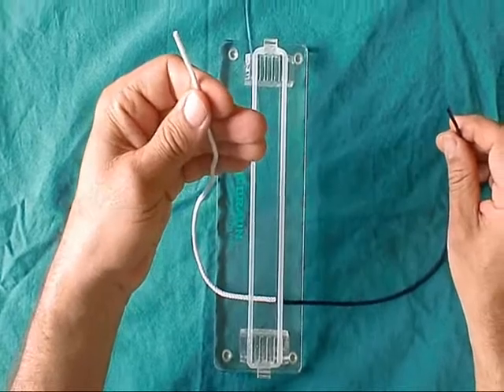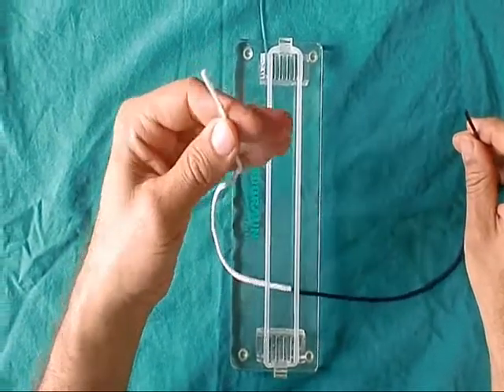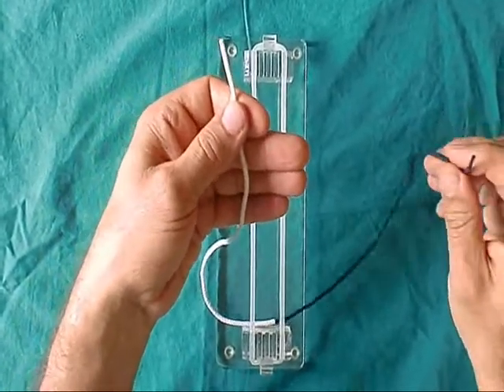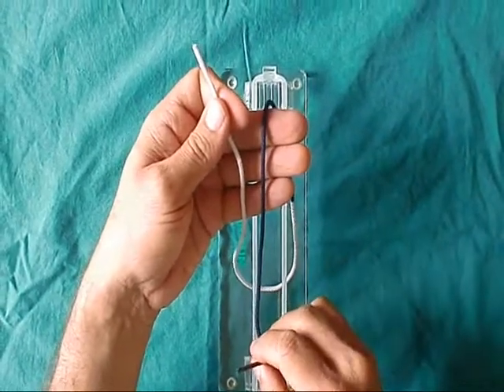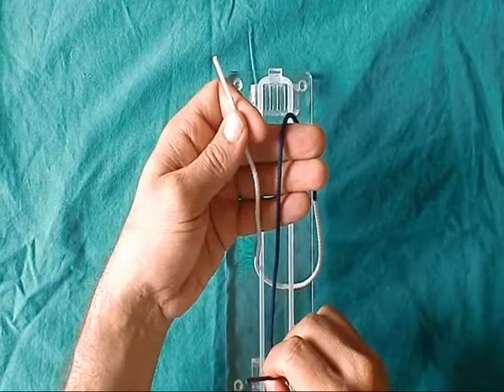Hold the thread in your left hand in this fashion. Make a loop with your right hand. Bring the thread in front of your left hand.